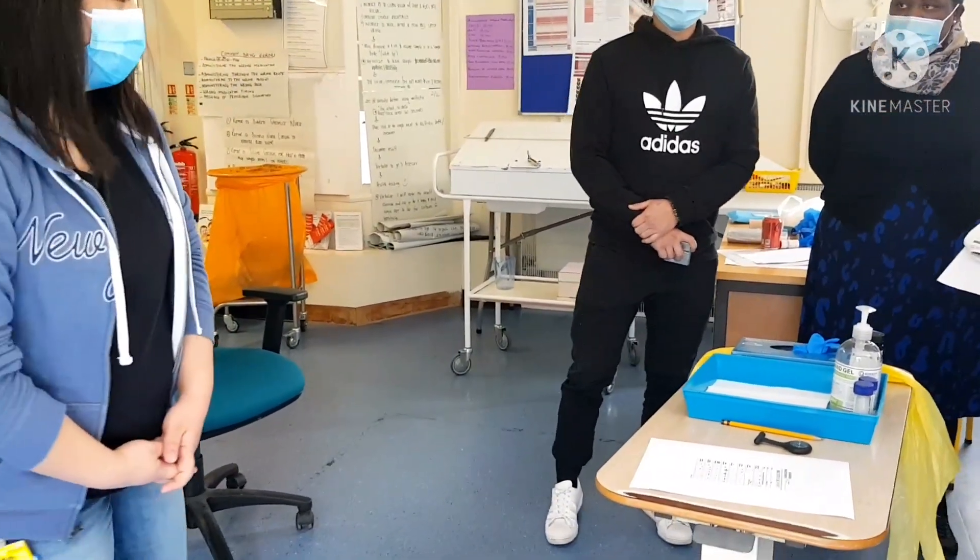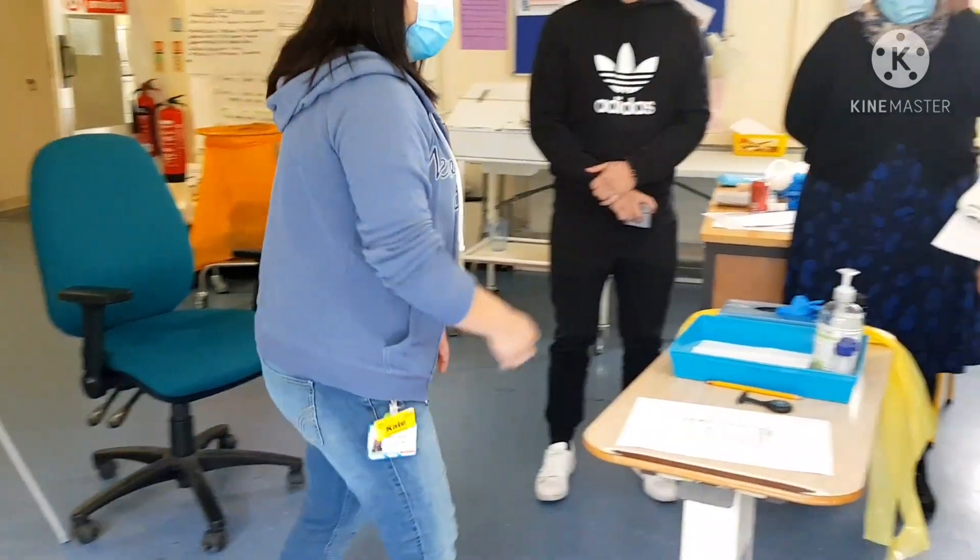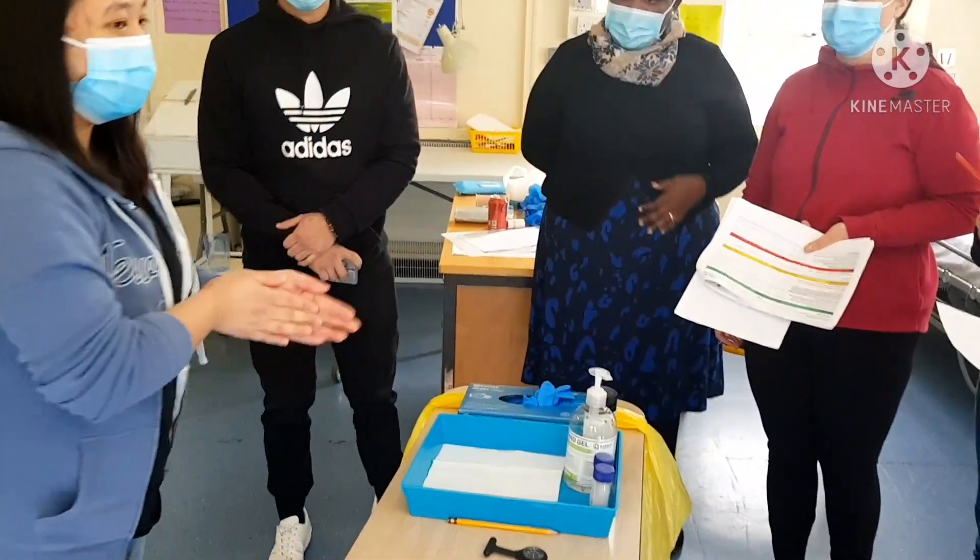As I enter the scene, I check the area for safety. I will close the doors to provide privacy, and I will do my hand wash following patient guidelines.